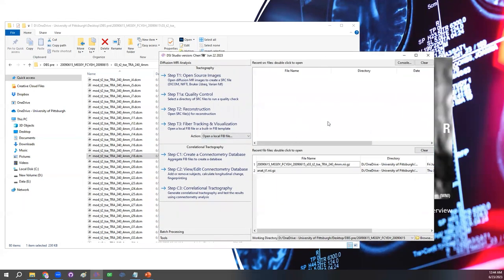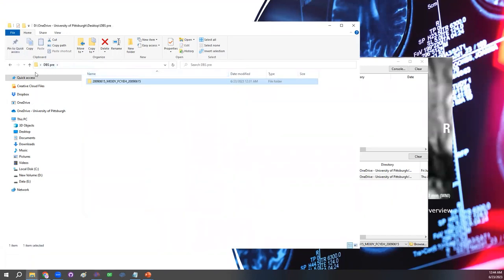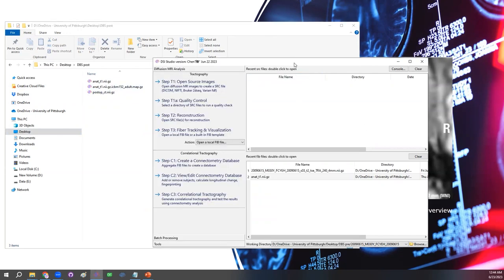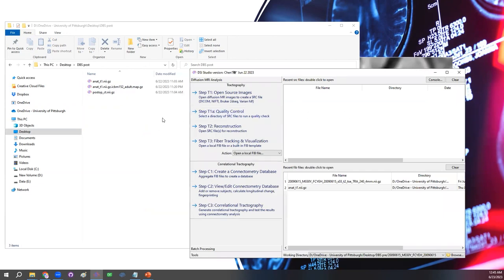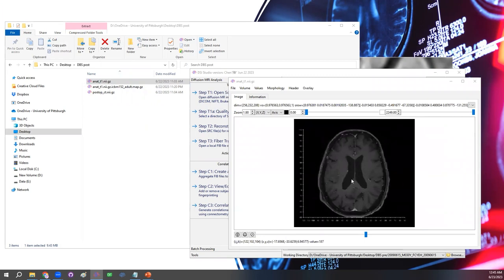Those are the simple steps to load any structural image modality — T1 or T2 — register it in DSS Studio, load built-in atlases, and output to DICOM. The next step is: what if we have already done the DBS procedure and would like to see how things look in terms of electrode placement and nearby regions? The data I'm going to use here was provided from National Taiwan University Hospital.